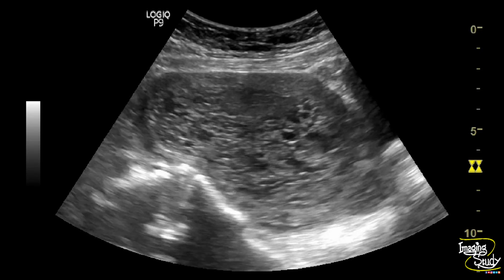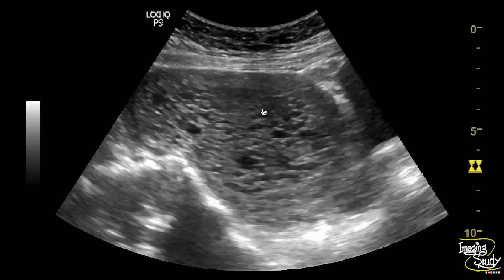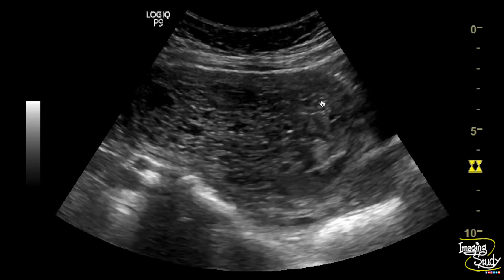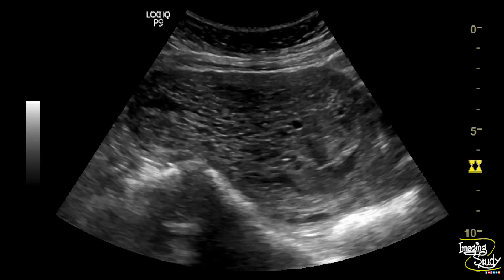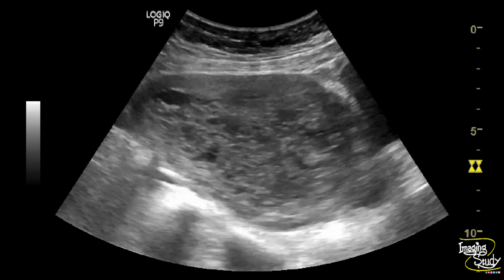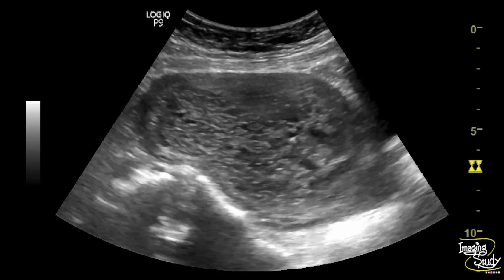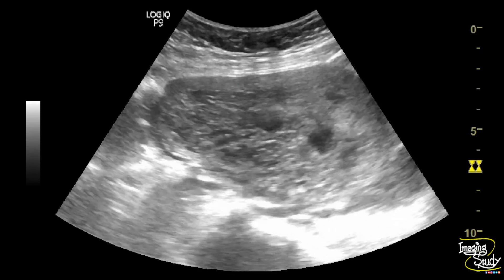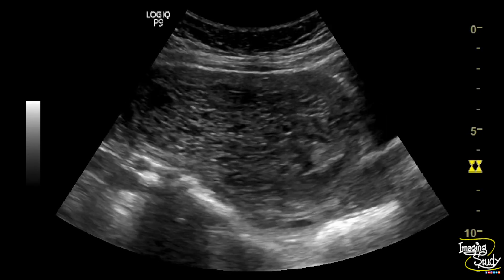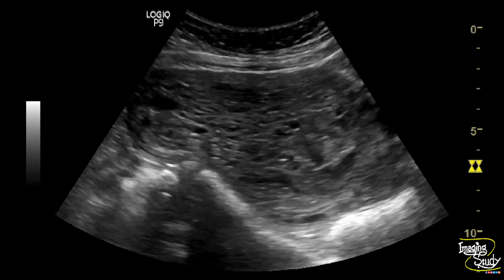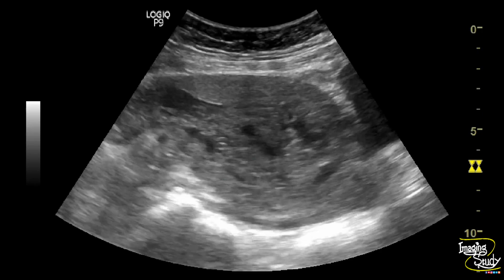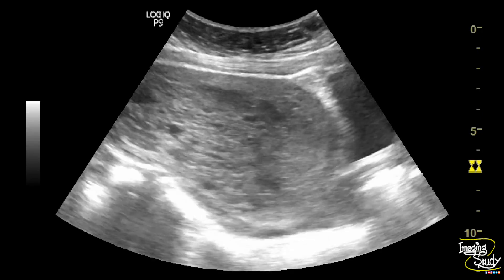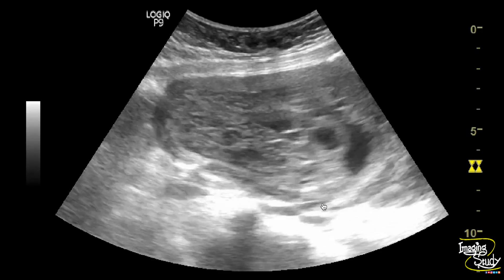Here you can see the longitudinal section of the uterus — it is bulky. You can see diffuse cystic spaces at the central part of the uterus. There are no associated fetal parts visualized here. These diffuse cystic spaces are forming the snowstorm appearance, which goes in favor of gestational trophoblastic disease.